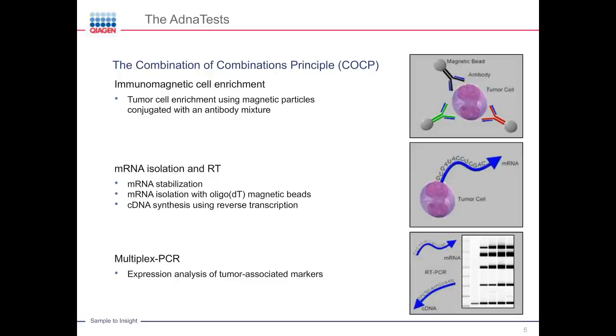And for instance, in many cases, 30% of the cases in breast cancer, for example, EpCAM gets lost and replaced by other more mesenchymal-like antigens. And using this mixture, we make sure that we will not lose the cells if this is happening.